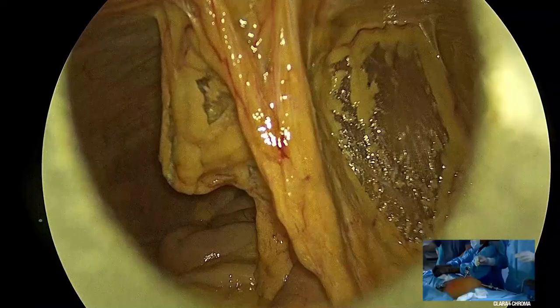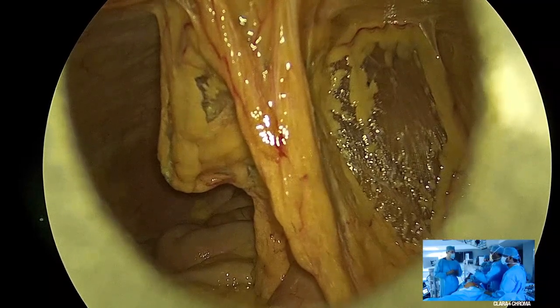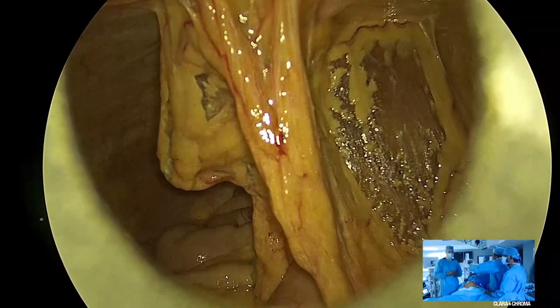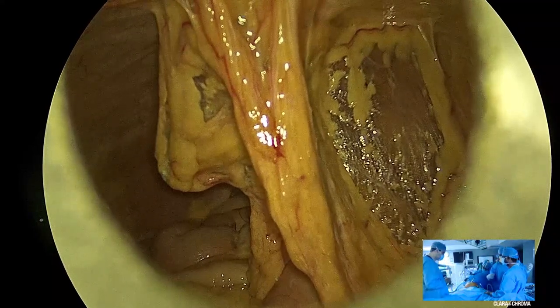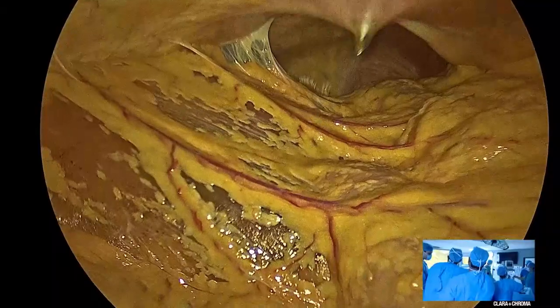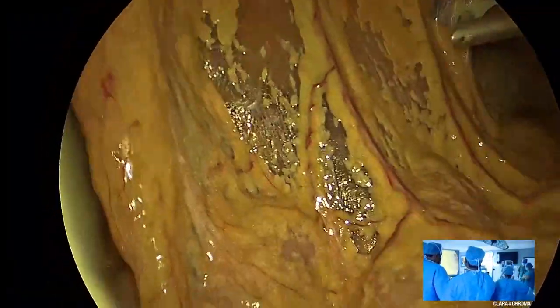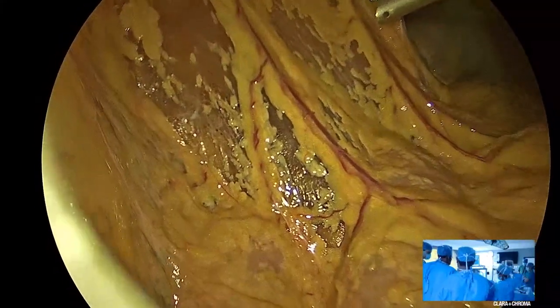Right, okay. Before we start the right hemicolectomy part, I'm just going to do the adhesiolysis. So, can you get the monitor this way? I'm going to stand between the legs a bit. So he's looking from below, from the lower camera. Come from the left side again. He's put it higher up. He's using a harmonic.